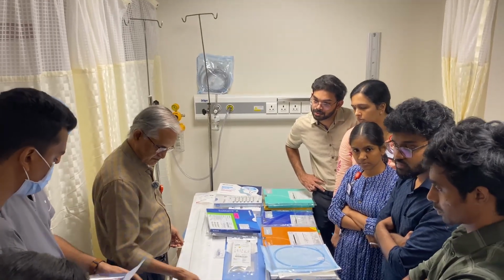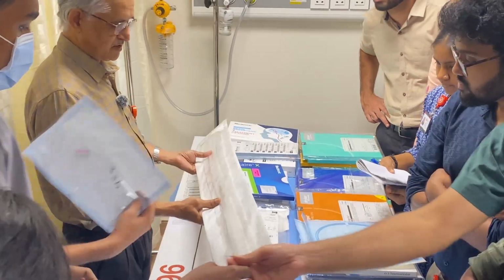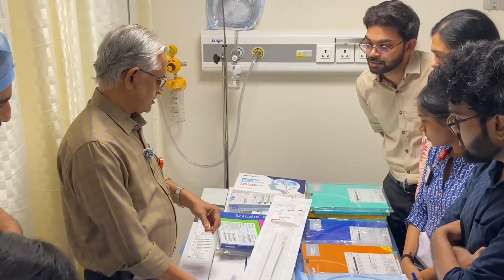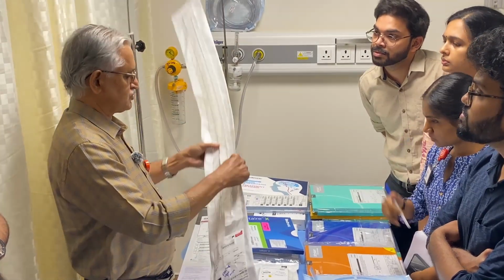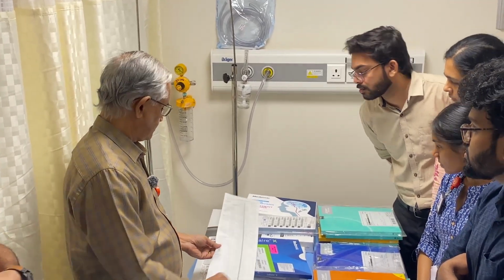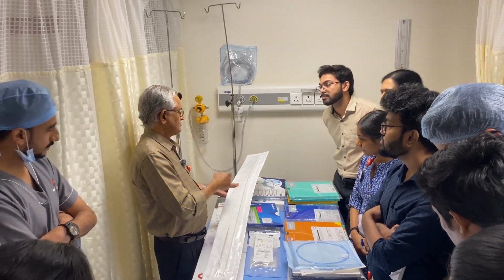Before going to the microcatheter, retriever and all, we should know the special sheaths which are used to access the carotid. These are called long shuttle sheaths. A sheath is a short sheath. Generally, a short sheath will be confined to the external iliac artery. It will not go beyond. This is a long sheath which you can take to the common carotid or even to the proximal internal carotid.